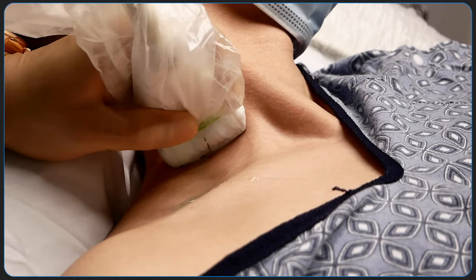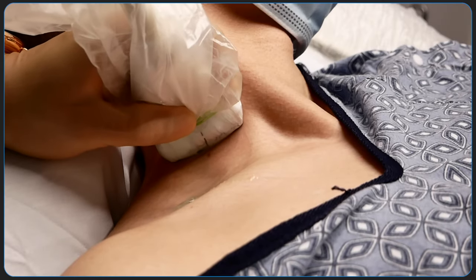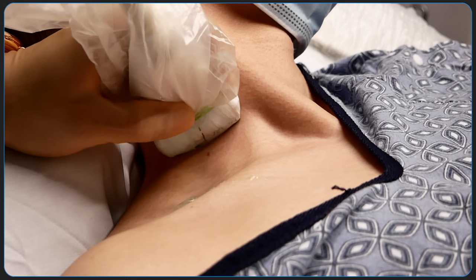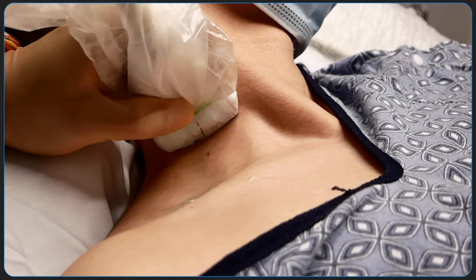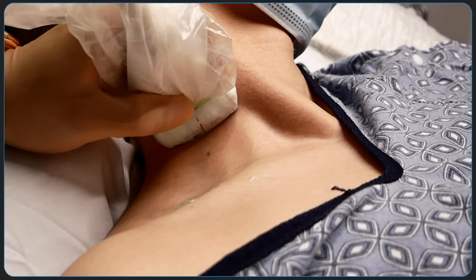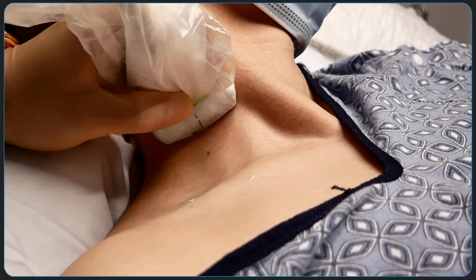In this video, we're going to demonstrate ultrasound mapping of cervical anatomy. We'll include views of the supraclavicular and interscalene block approaches, as well as tracing of cervical nerve roots to their respective neuroforamen.